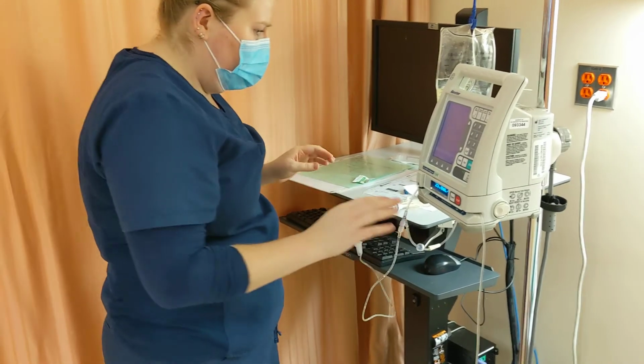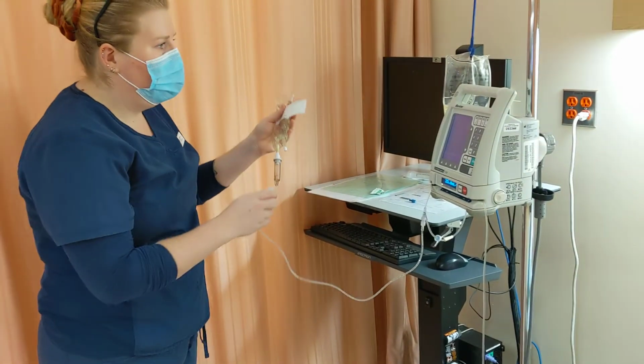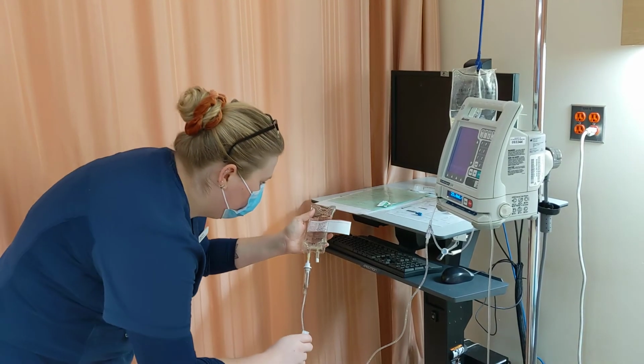Once I've done that, and we make sure that we haven't broken any sterility here, I'm going to take my mini bag and put it lower than our primary so that we can back prime.